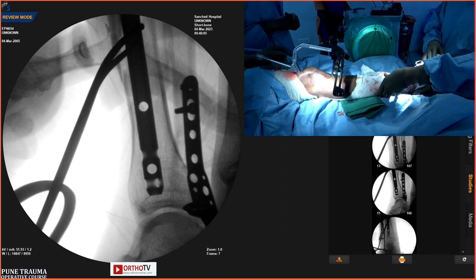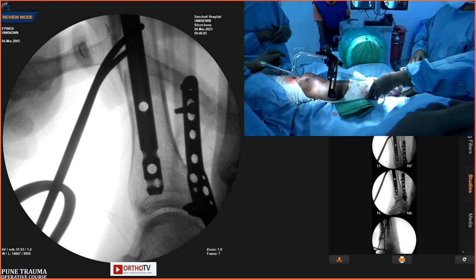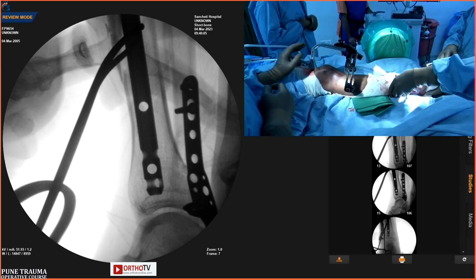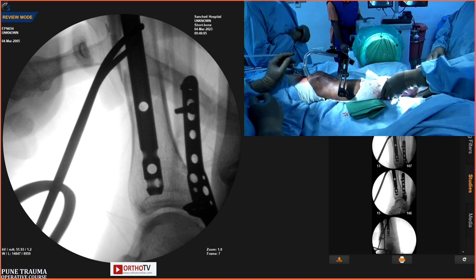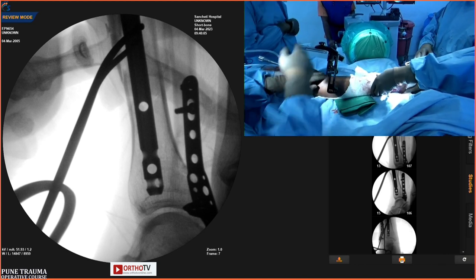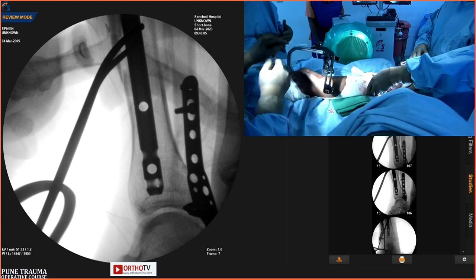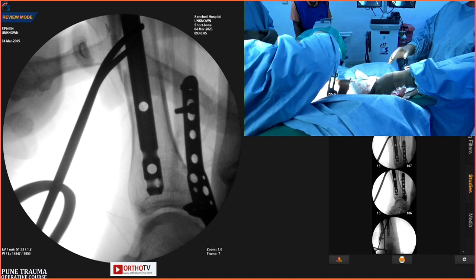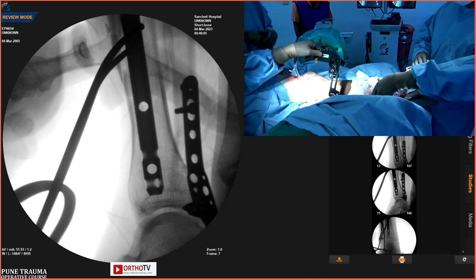Yes, better. The ideal placement, which was previous literature, was center. Now the literature says in suprapatellar nailing, it should be slightly anterior and slightly lateral to the midline, which prevents your valgus and recurvatum deformity. So I think it's a perfect placement of the nail. And we will do 3-4 locking here.